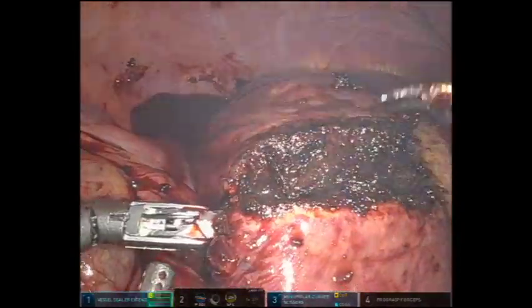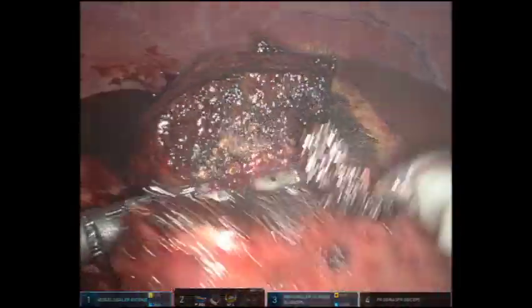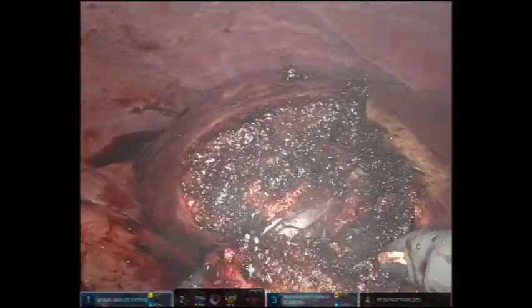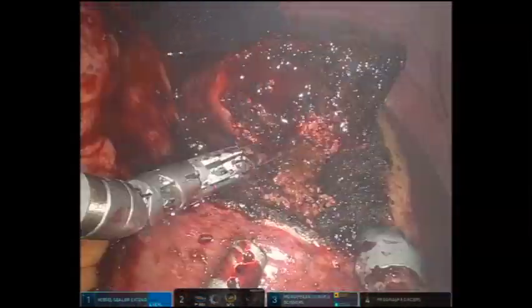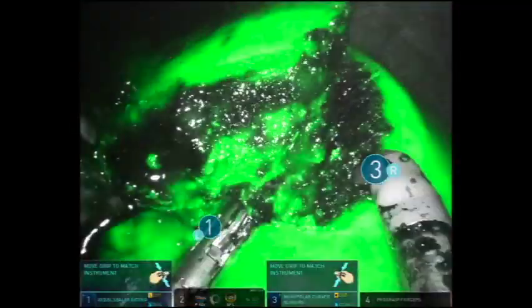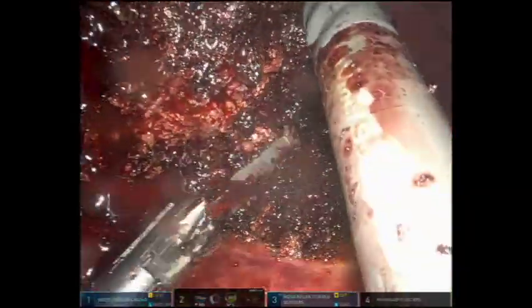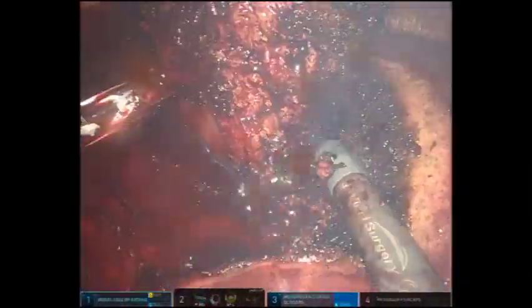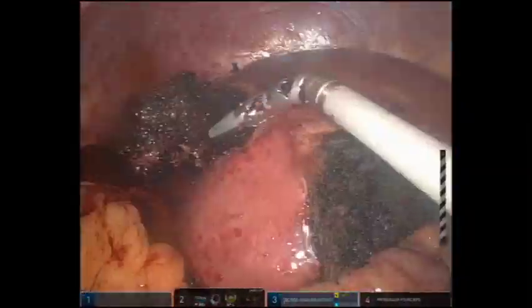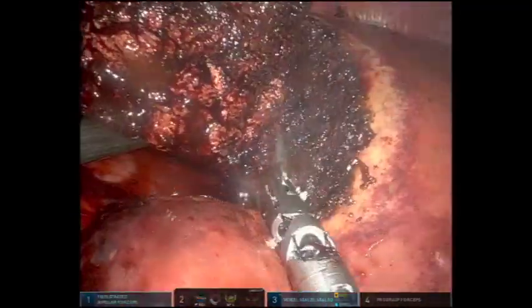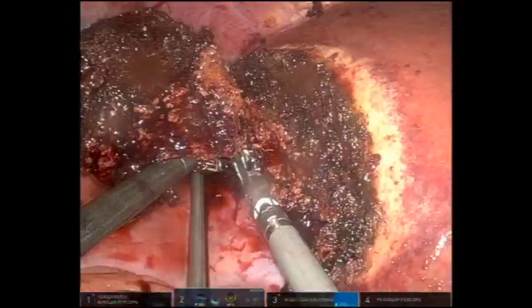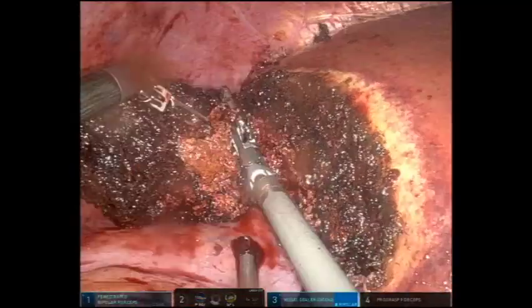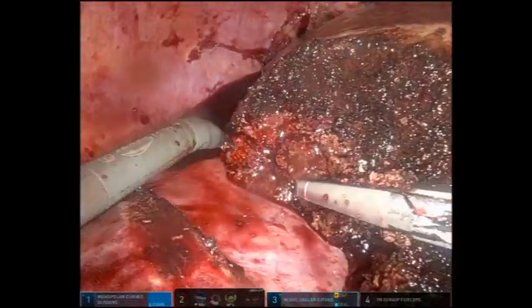The vessel sealer was again used to ligate larger vessels. Once the majority of the resection was completed, the margin was again assessed using fluorescence angiography and visible tumor was not seen. The resection was completed using a combination of the scissor and the robotic vessel sealer, and the liver edge was cauterized with the scissor.